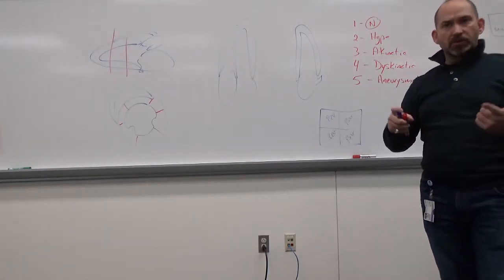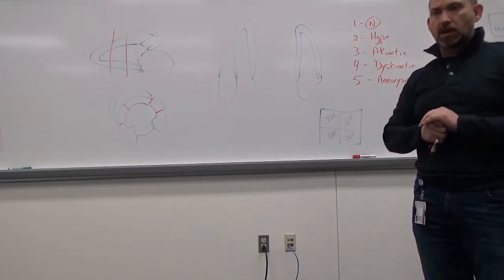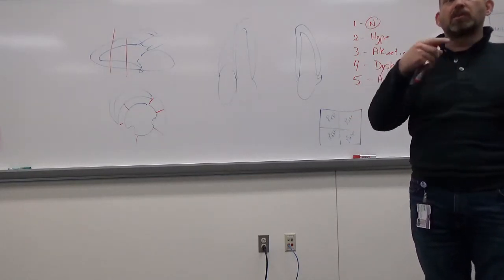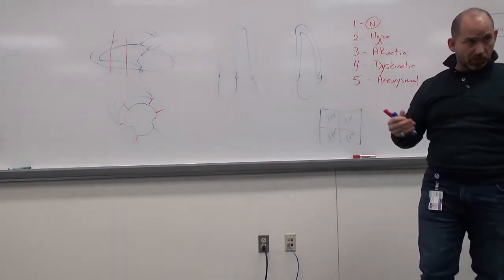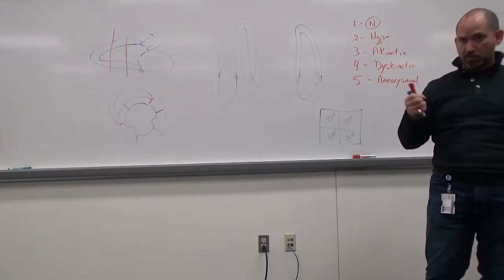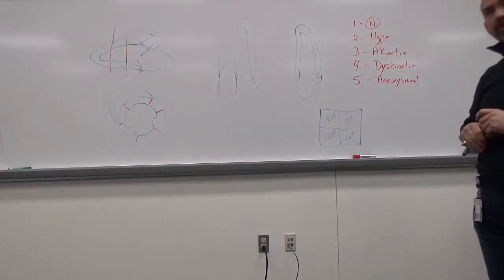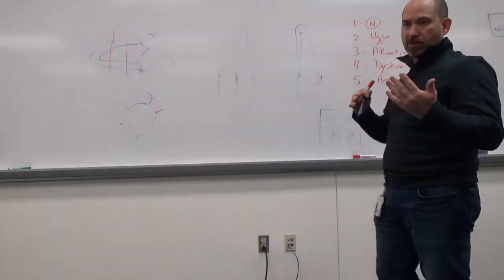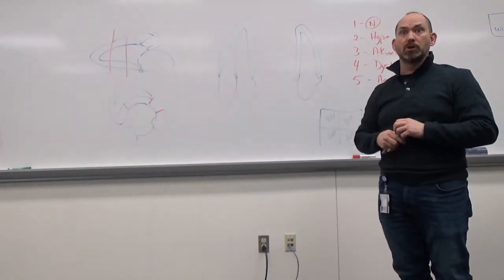So we have a bicycle. The original was done on an upright bike, a stationary bike, and they still have to put them on the bed and scan afterwards, like we do on our treadmill. The treadmill is pretty straightforward. According to the Bruce protocol, it goes higher and faster every 3 minutes. We're going for what's called the METs, or metabolic equivalents. It's their way of putting a quantification on how far they've pushed.